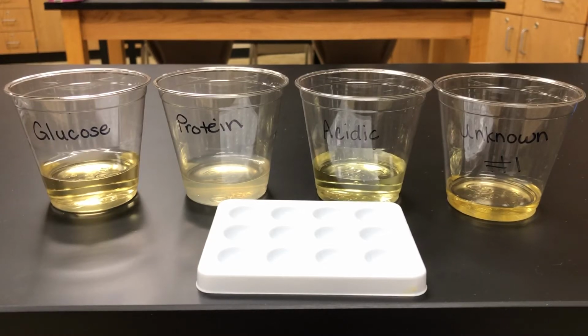This is the Urinalysis Testing Lab. Please have your lab sheet available and follow along with me as I go through this. So in humans, urine is a fluid produced by the kidneys as they remove waste from the blood.